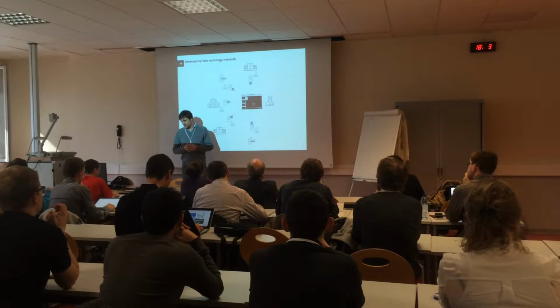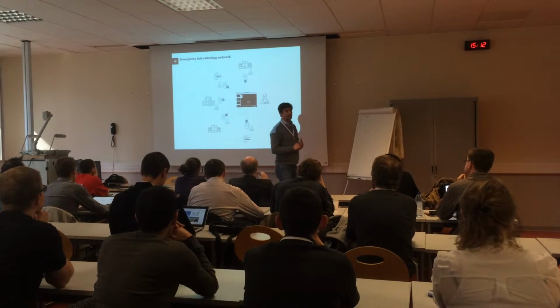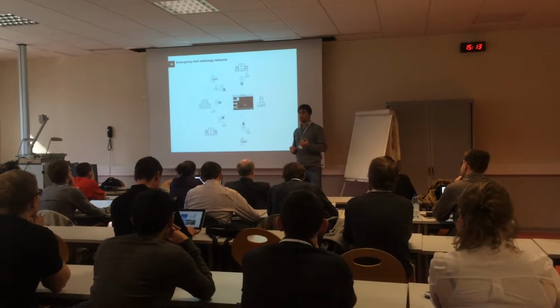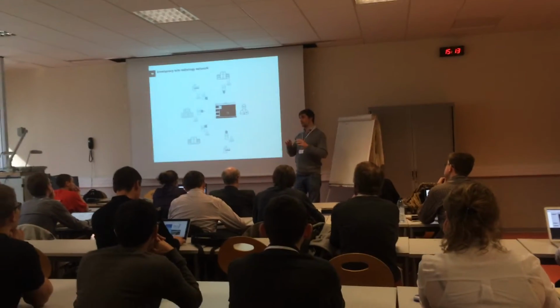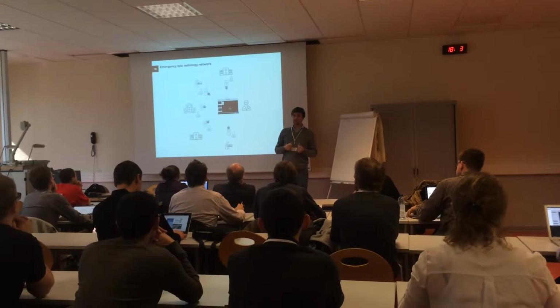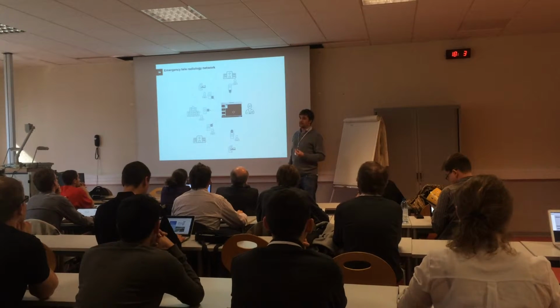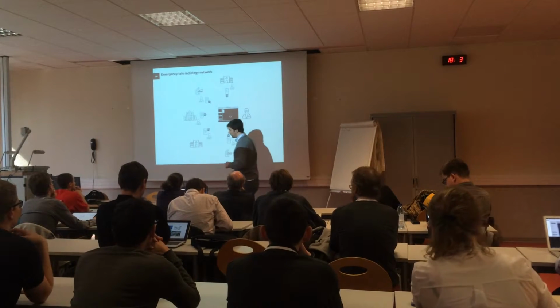Another implementation that is taking place is one in the south of France. The PACA region has 60 hospitals that have integrated their emergency rooms with Orthanc. So each hospital has an Orthanc on their PACS system, so that a central radiologist can have a look at those images, so they can actually economize, save a lot of money in not having to have an emergency radiologist in each hospital. So they saved a lot of money thanks to that.